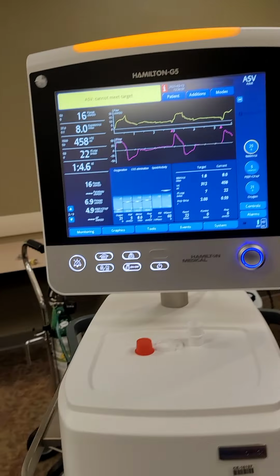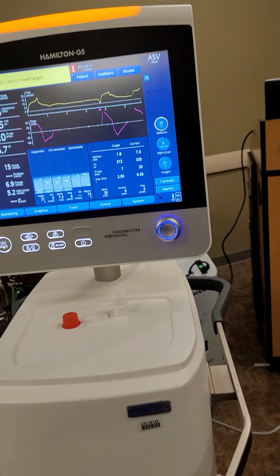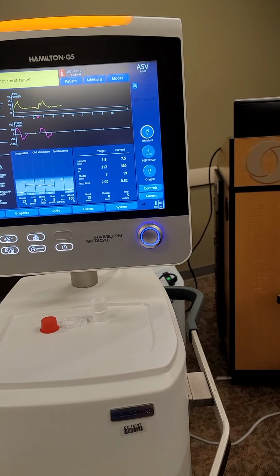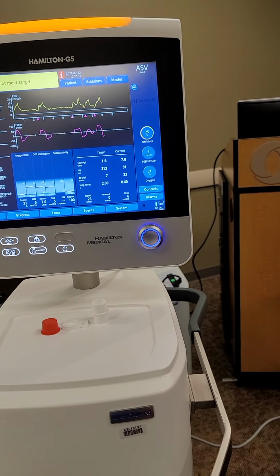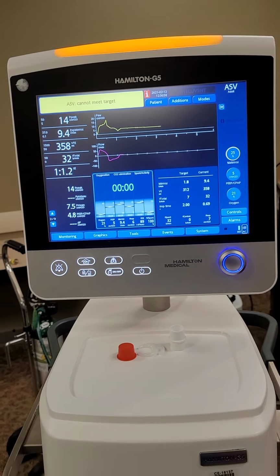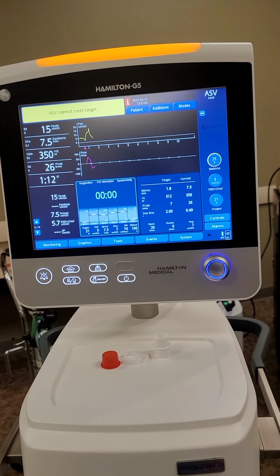So one last question though. Would you recommend, in my experience, I've seen patients above 12 of PEEP don't do well on ASV. Like people who have severe restrictive lung disease. Would you recommend that with ASV? Yeah, if you don't know where to go with rate and tidal volume. No, you can even do an ASV consult. Yeah, if you're restrictive, there are high PEEP. I'm looking at about 12 to 14 of PEEP, really.